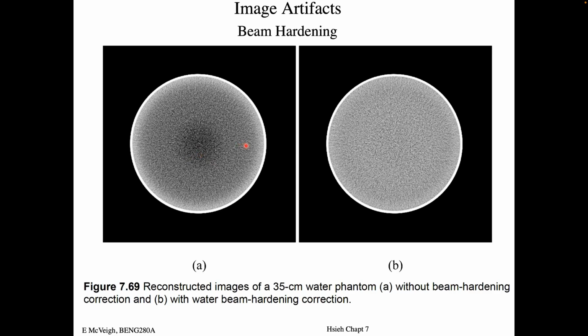because you need to compensate for the fact that pixels in this region, before they see any X-ray at all, regardless of which projection angle that X-ray is coming from, that X-ray has gone through half the depth of this material, right? Whereas a pixel right here, when it sees it coming this way, it sees a lower radiation beam that has lower energies in it.